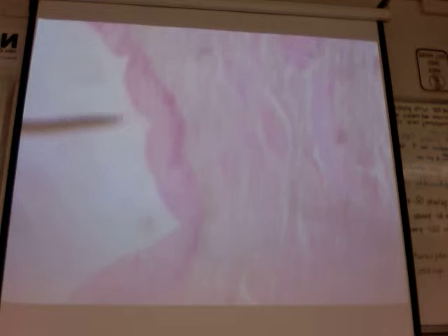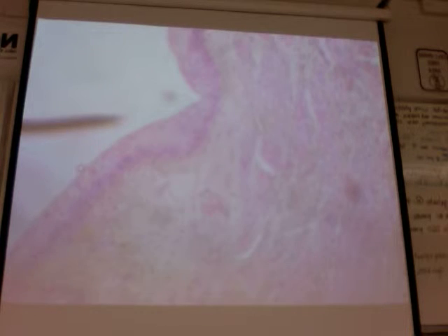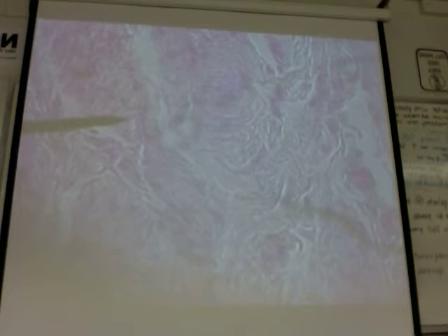So that's the epithelial tissue right here at the end of the pointer. And at higher magnification, it looks like this. So this is the ureter. It's a little bit flatter than I'm used to seeing, but so the transitional epithelium in the ureter, and also the other thing is this muscular wall of the ureter.